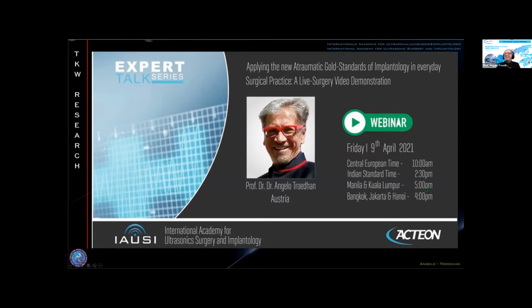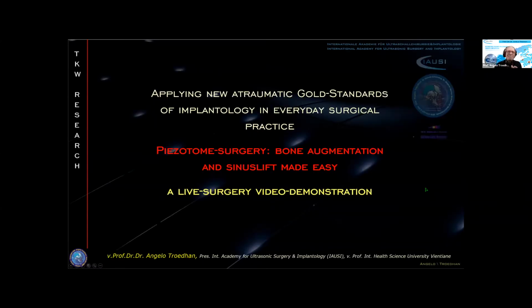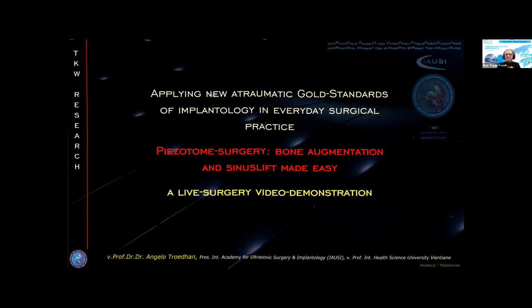So instead of doing theory, we will step right into a case which covers, let's say, mostly about 50 to 60% of the cases that we face every day with patients that demand to have implants inserted, but they are lacking bone.